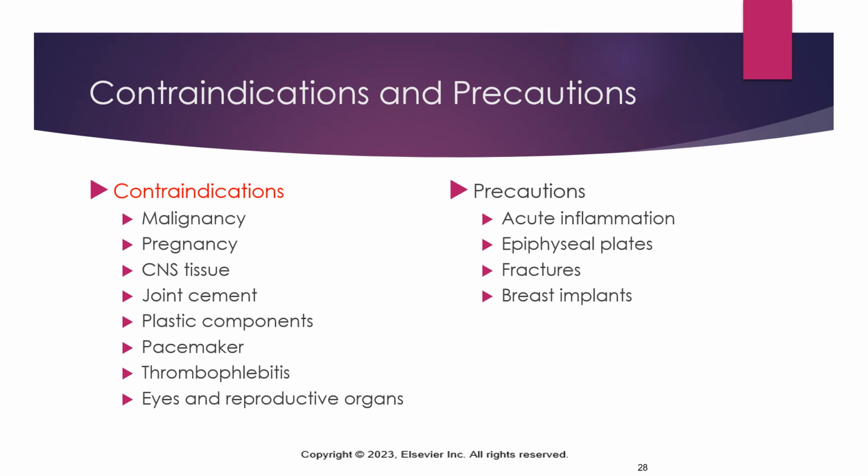We're going to stay away from the abdomen region. I would even stay away from the posterior portion of the spine if somebody's pregnant. We don't want to cause any heating deep into the tissues whenever there's a fetus present. We don't really want to mess with that development at all. So we're going to stay away from that area with our women who are pregnant.